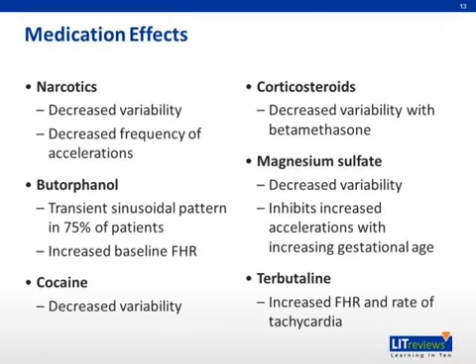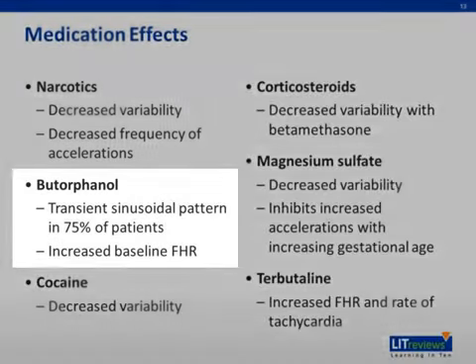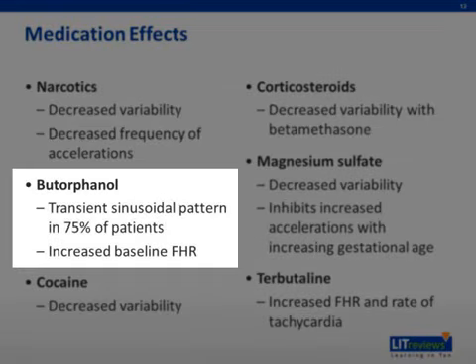Medications can affect the electronic fetal heart rate monitoring. Narcotics can lead to decreased variability and decreased frequency of accelerations. Butorphanol can lead to a transient sinusoidal pattern in 75% of patients. However, the sinusoidal pattern in this context was not associated with adverse fetal outcomes. Butorphanol can also increase the baseline fetal heart rate.